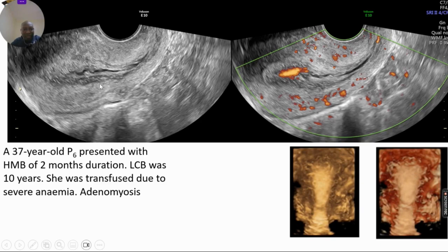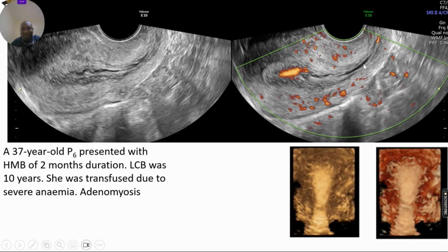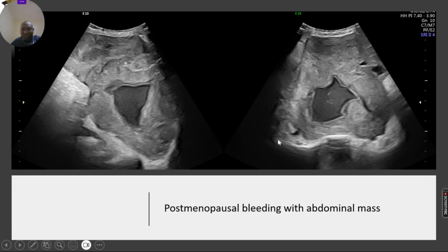This patient presented with heavy menstrual bleeding of long duration. Look at the irregular endometrial cavity — if you look at the endometrium, you can see it extends into the myometrium, with heterogeneous myometrium, again a feature of adenomyosis. This color flow within the endometrial cavity is actually movement of blood due to heavy flow — if you apply spectral Doppler there will be no vascular pattern. On 3D you can see the adenomyotic features. This patient left against medical advice so we do not have a histological diagnosis.